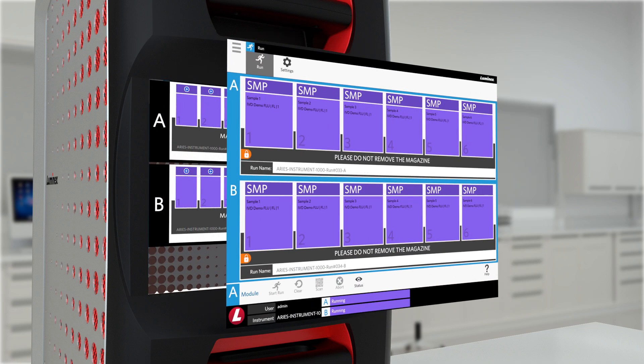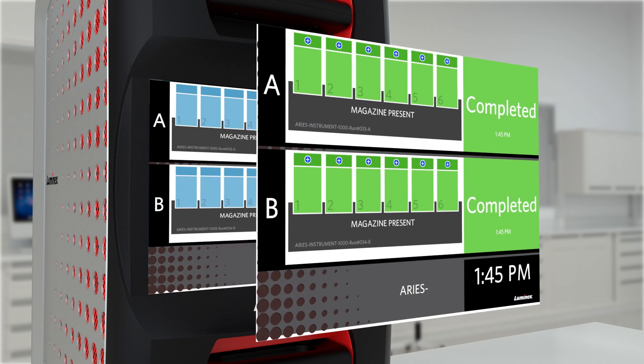Test reports can be viewed on the ARRI's touch screen, or they can be sent to the LIS and printer.